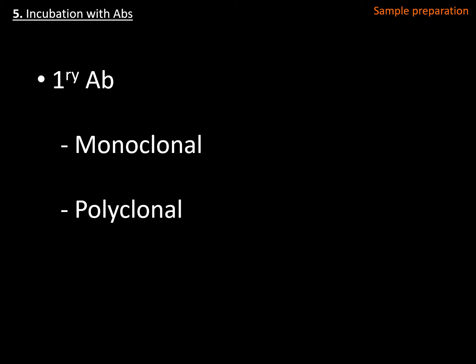After that, the animals are bled and the antibodies retrieved, and here you will produce a collection of antibodies that will have the capacity to bind your antigen at different locations, thus allowing more than one region of your target to be labeled.